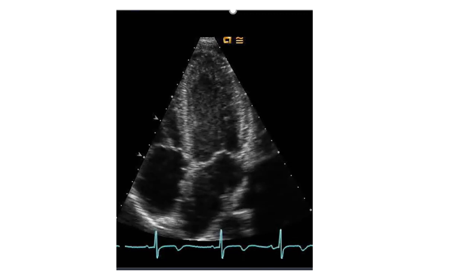Now we will go through the apical windows, and in the apical window we can get multiple views also. The first of them is the apical 4-chamber view. This is the probe lying at the apex, and what's anterior and closer to the probe appears above on the screen, and what's posterior and away from the probe appears below on the screen.